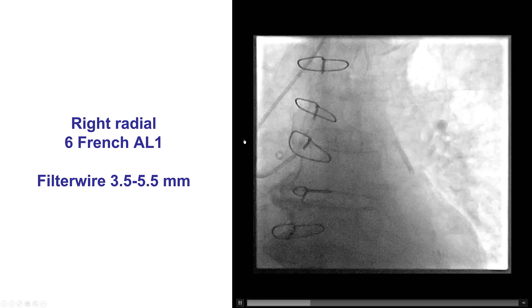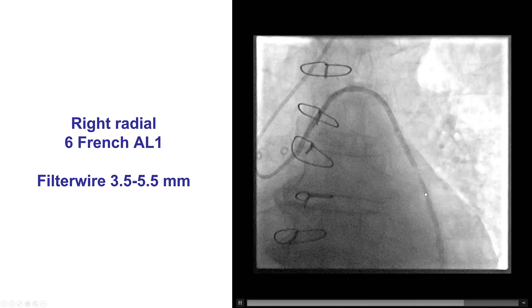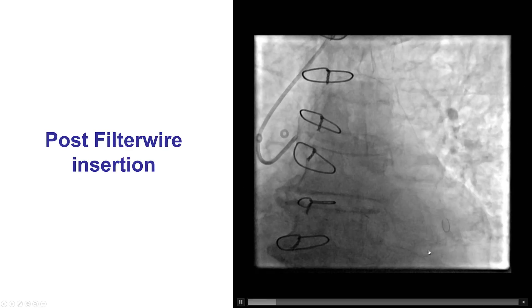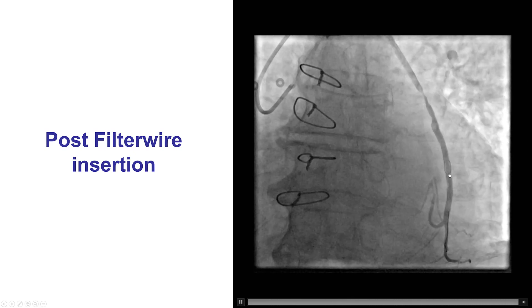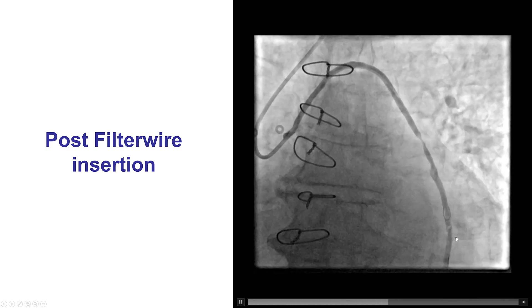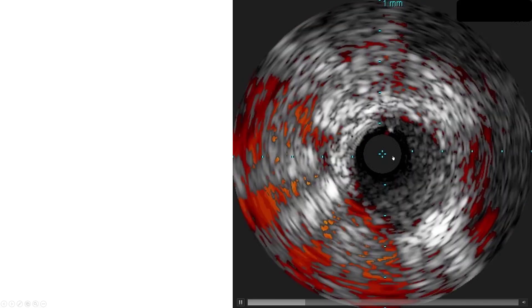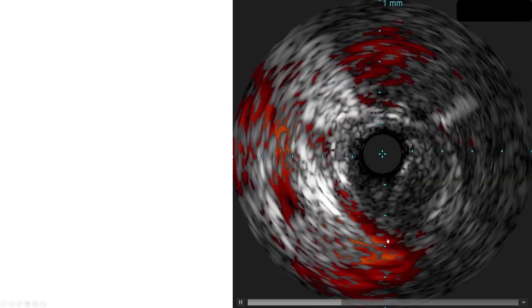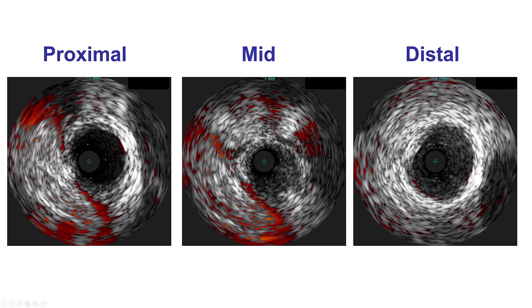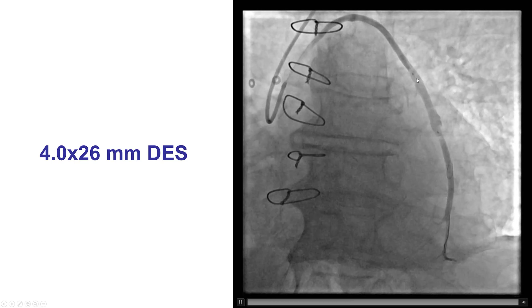In this case, we used a 6-French AL-1 guide catheter and a 3.5 to 5.5 filter wire, since we had a long enough distal landing zone. We performed an angiogram after insertion of the filter to ensure we did not have any embolization, because sometimes just crossing the vein graft lesion with the embolic protection device may result in distal embolization. We then performed intravascular ultrasound through the saphenous vein graft, showing soft plaque with a reference diameter of approximately 3.5 to 4.0 millimeters — about 4 millimeters in diameter. We placed a 4.0 by 26-millimeter drug-eluting stent, which appears slightly oversized compared with the proximal and distal portion of the saphenous vein graft.